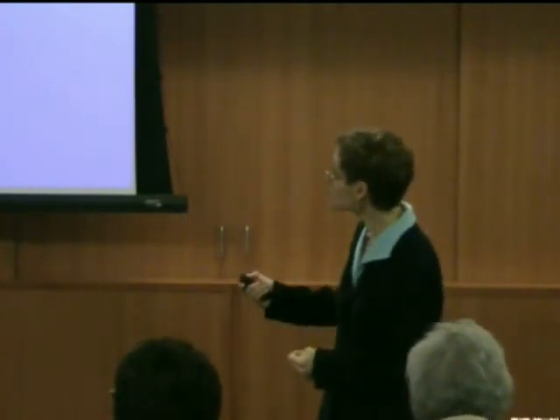If you have tremor from another cause, sometimes it's a little bit harder for the DBS to treat. An example of a tremor from another cause, again, if you had a stroke or an injury to a certain area of the brain, it's harder to treat. Also, if you have essential tremor, some parts of the tremor are easier to treat than others. So in essential tremor, people have tremor in the arms, they can have tremor in the voice, and tremor in the head, back and forth, up and down.